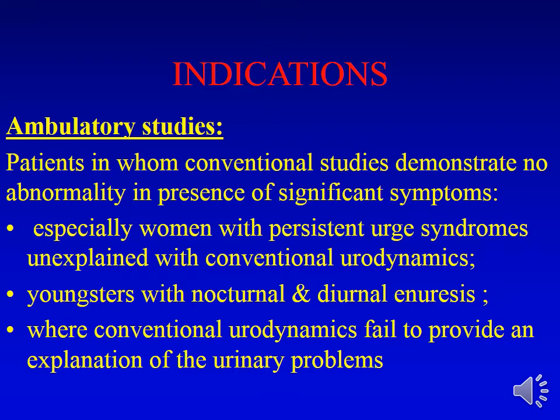Now, what are the indications of ambulatory studies? We very rarely do ambulatory studies. But ambulatory studies are basically putting in a catheter and asking the patient to walk around for a few hours or the rest of the day, and measurements are done. Now, we can always have false measurements, so one has to be able to read the tracings properly.